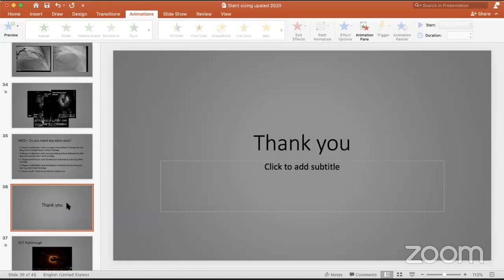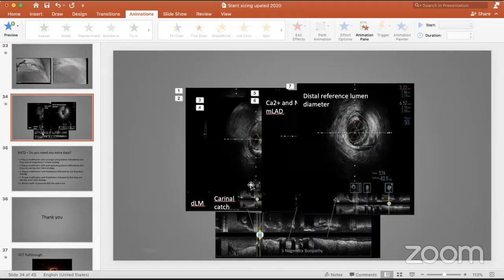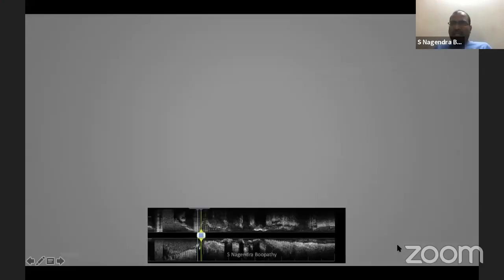Because it's a deeper calcium, no? You saw that in the distal left main, the calcium is deeper. Will a rota reach there? We do plaque modification, whereas shockwave will do better. By theory, it should do better now, where the calcium is not that deep.